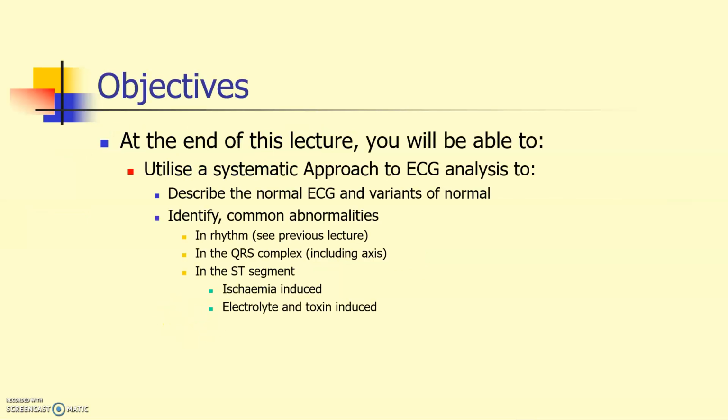At the end of the lectures, you will be able to utilize a systematic approach to ECG analysis to describe the normal ECG, to identify common abnormalities in rhythm, in QRS complexes, and in the ST segments.